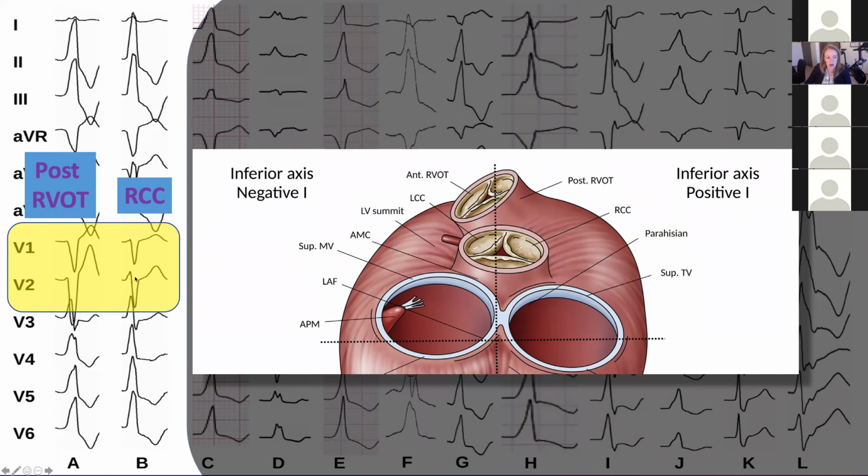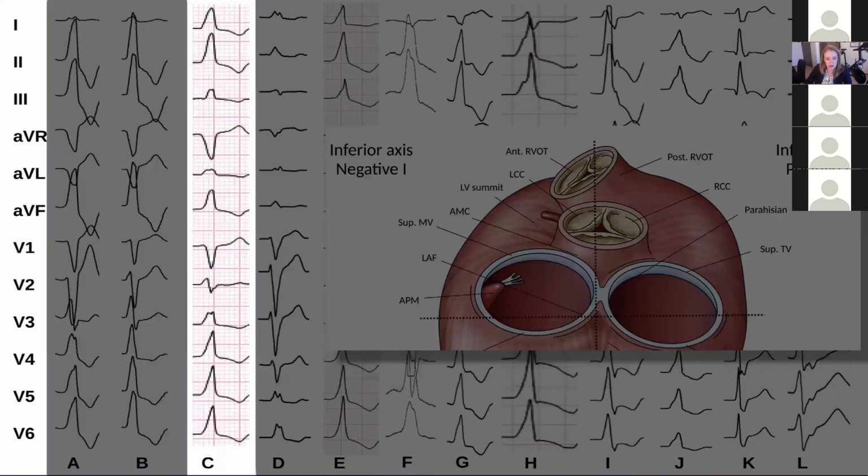And it's actually fairly wide in V2. And if you draw a line up to V1, you'll see that there is actually a fairly broad R wave there. It's just low amplitude. That's another thing to say. So just like your delta wave algorithms, we really should be drawing those vertical lines, trying to look at these EKGs. These are rhythm strip EKGs, right? Not just the standard 12 lead EKGs, so that we can really compare where the onset is in neighboring leads. So here's another example.